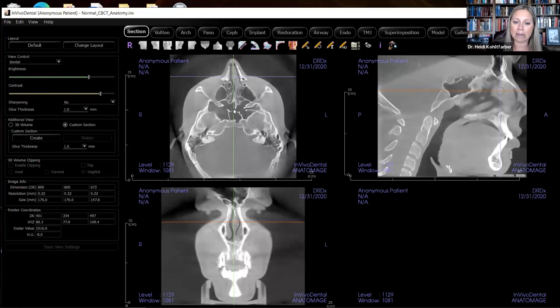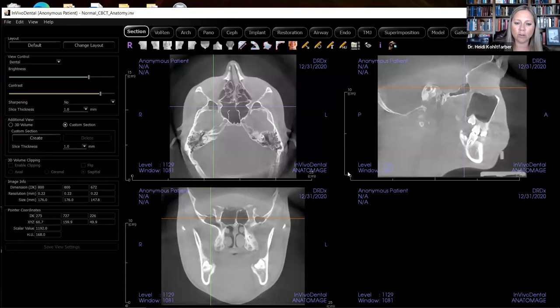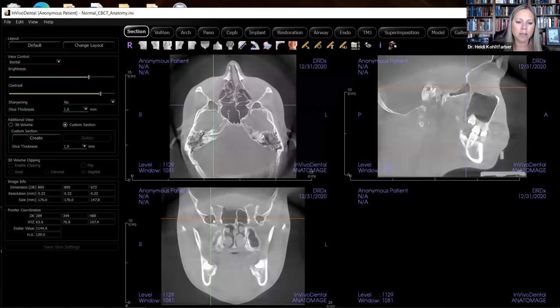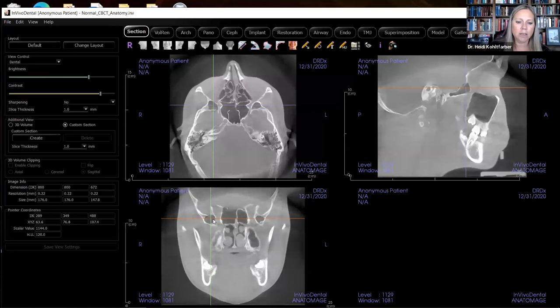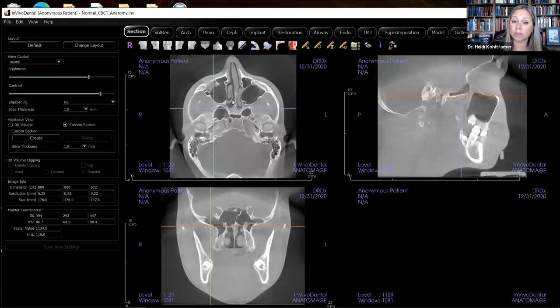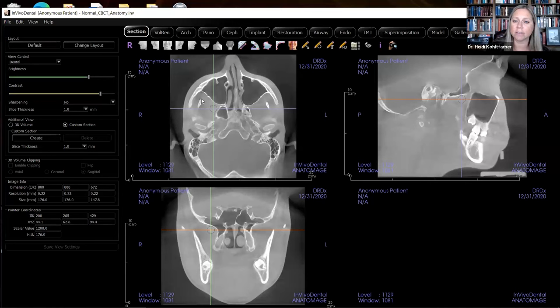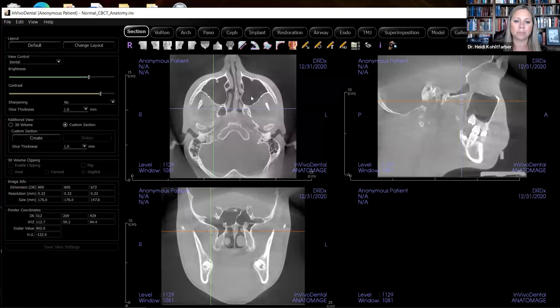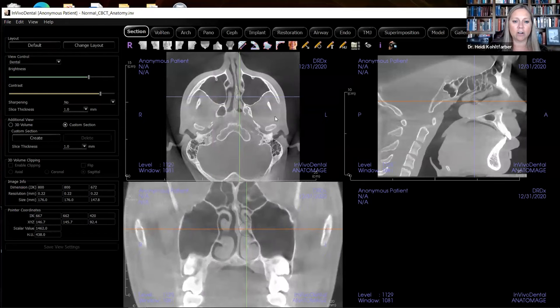Going down through, looking at the frontal sinuses, I see the ethmoidal air cells and the sphenoid sinus opening up. If you're not sure what you're looking at, take the crosshairs and look in all three planes — you'll be able to see that you're just looking at a pneumatized sphenoid sinus. Using crosshairs is very beneficial if you have any questions. Going back down through, I'm looking at the nasal septum and the maxillary sinuses. I want to make sure those cortical borders are nice, smooth, and intact. Thickening and sclerosis of these cortical borders would indicate a chronic inflammatory process like chronic sinusitis. This patient does have a left deviated nasal septum, which may decrease airflow on the affected side.